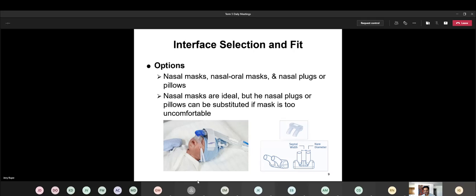And then the leak is gone, or pretty much non-existent. Or sometimes it would just be flat out, I overestimated the size of the cap. And like, no, you've got to get a smaller cap than this. A cap that looked like it wouldn't fit on the baby's head. But then they would put it on, and it ends up being a tight fit, but everything works perfectly at that point. So that's definitely a skill, because in the beginning, again, I struggled.